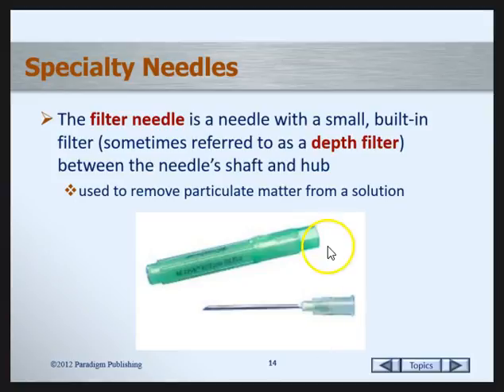On a filter needle, it is contained in a plastic outer packaging that has a split here where the pointer is locating. You twist it and the bottom part comes off to expose the end of the hub. This will be your sheath that will protect your shaft. You can then hold on to this part and attach the open hub to your syringe unit.